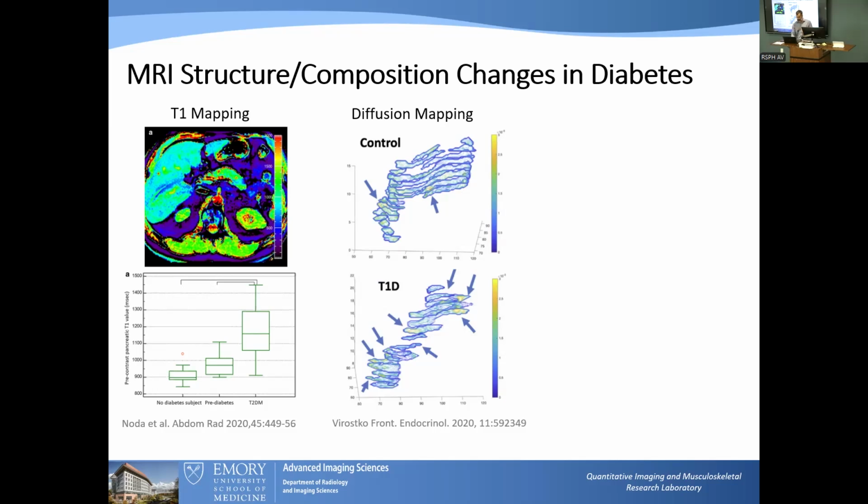And you can see, in this kind of weird exploded view in 3 space of the ADC map, in this type 1 diabetic example, these yellow spots that reflect elevated levels of apparent diffusion coefficient, which would be consistent with the inflammatory phase of type 1 diabetes, T cell infiltration. So you would expect to see a swelling and tracking of fluid that comes in. And certainly these focal points are detectable using this apparent diffusion coefficient imaging.